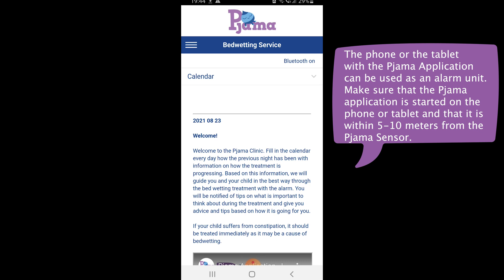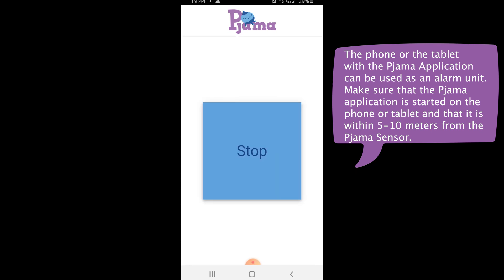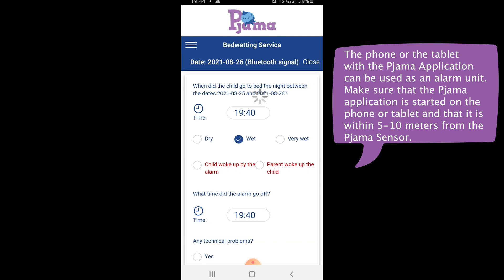If the phone or tablet is to be used as an alarm device, it looks like this in the application. The alarm sounds and it is stopped by pushing the stop button on the screen. The calendar will automatically be opened with the time of the alarm already filled out. You can also see that the time when the child went to bed has already been entered. Complete the calendar entry and save the information.